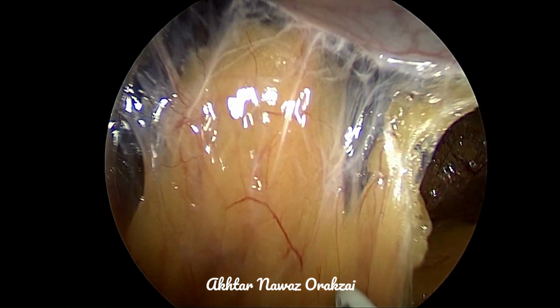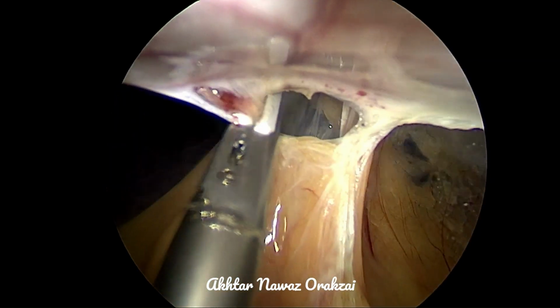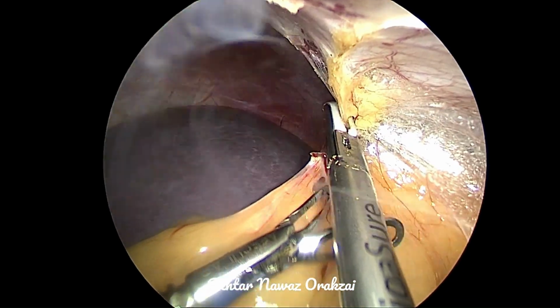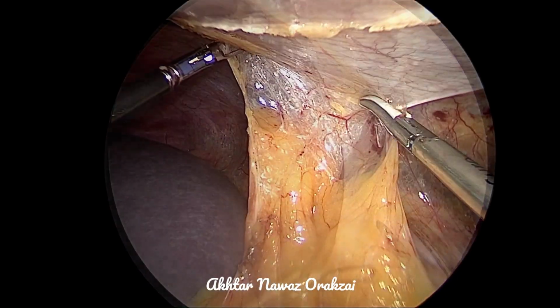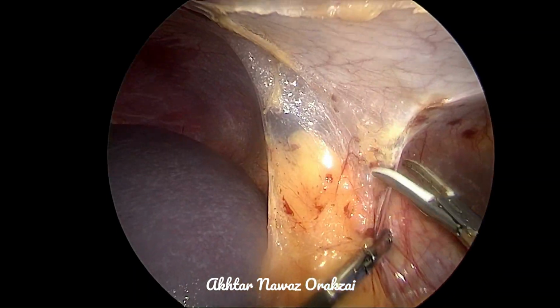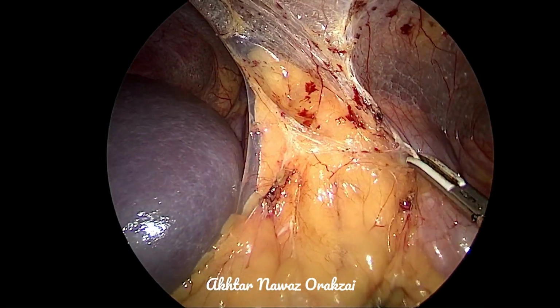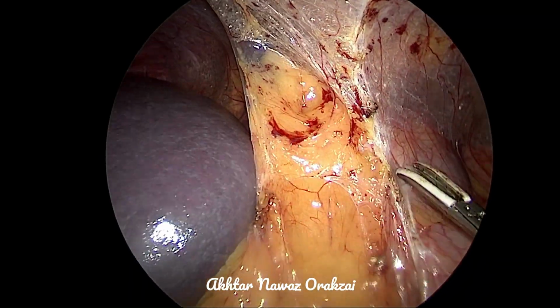Let's discuss the procedure now. The port placement for nephrectomy, whether that is a simple nephrectomy or radical nephrectomy or a pyeloplasty or a pyelolithotomy or a ureterolithotomy for a stone in the proximal ureter remains the same. And I use the triangular method for my procedures on the kidney, as I already discussed in the previous video of a lady with a BMI of more than 40.